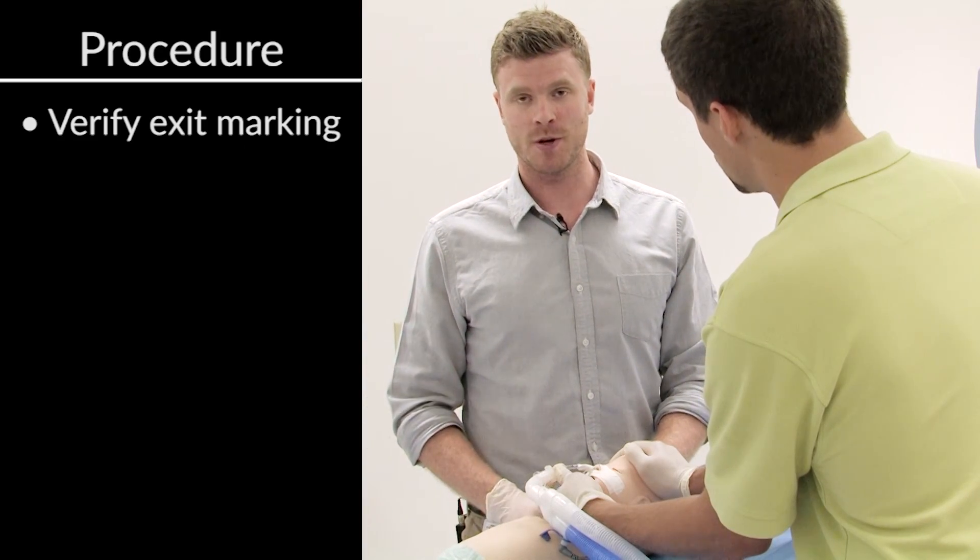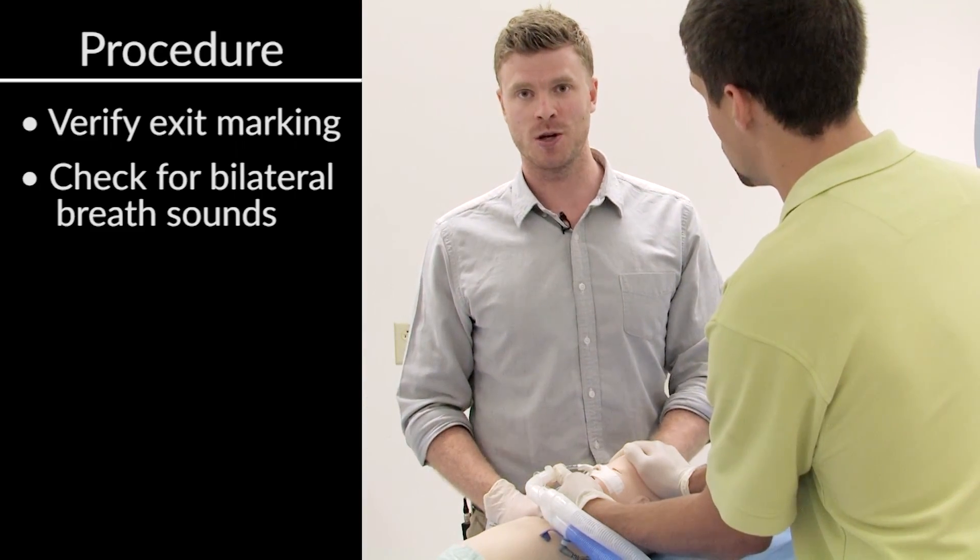That looks pretty good. We're at the appropriate exit marking. We'll verify breath sounds, and we're all done. That concludes our session on re-taping nasal and oral endotracheal tubes. Thank you.